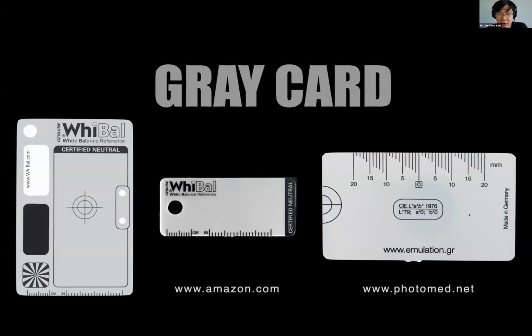And this is something you don't have to do. All you need to do as a clinician is take the photo and send that photo to the lab, and the lab will be doing this. The important part is that you can learn how to take photos and use instruments, but your lab also has to know how to process these photos.